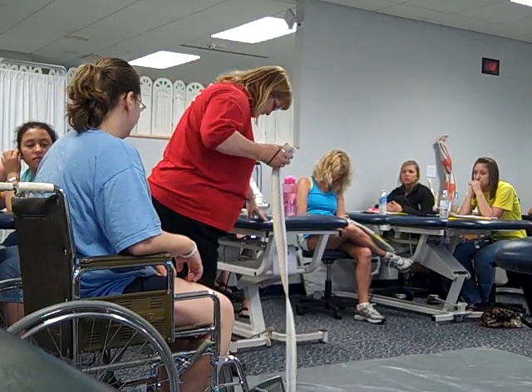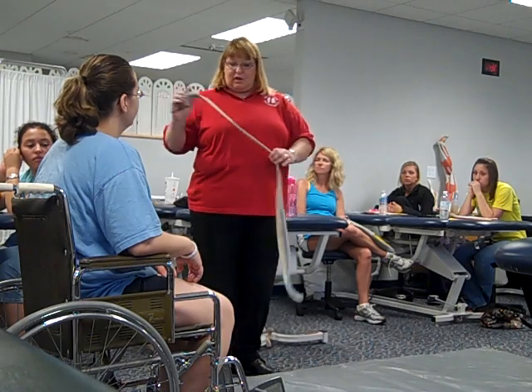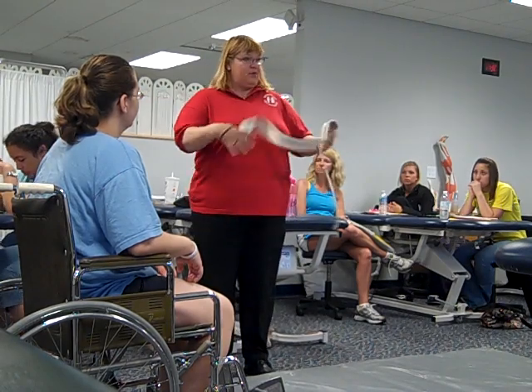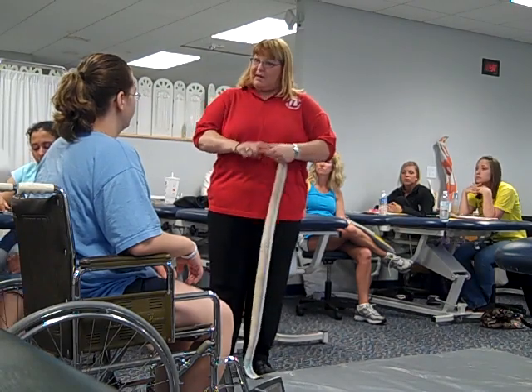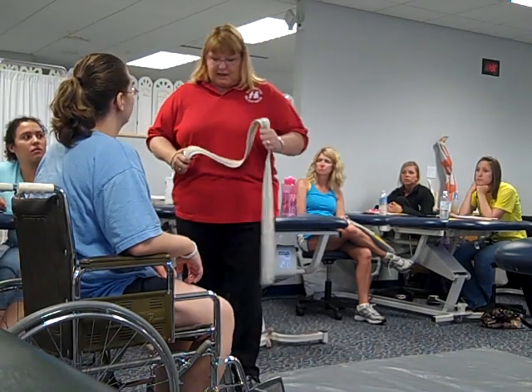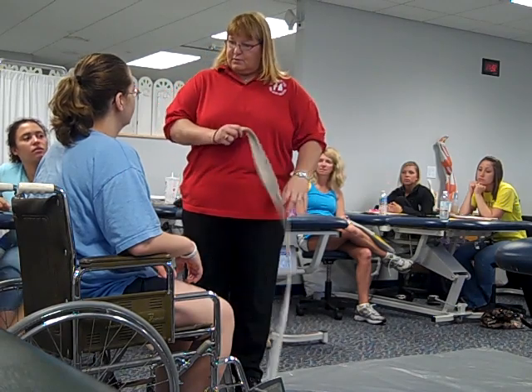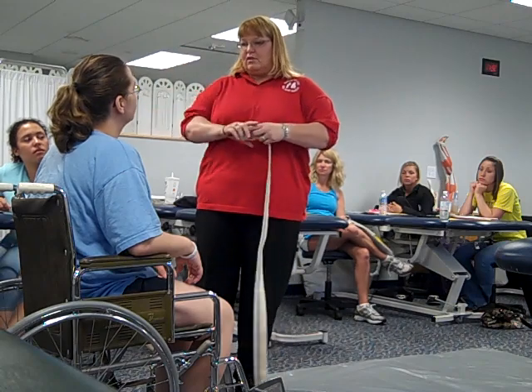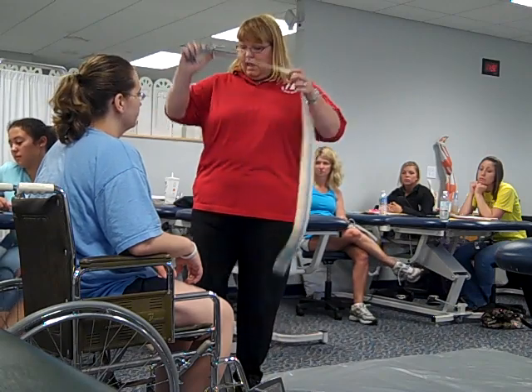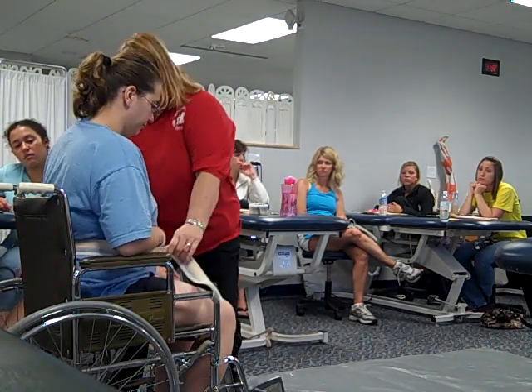For this one, remember we're saying that the patient's going to be a right-side hemiplegia, and we're talking about how to get down to the mat before we do the mat activities. So you're going to get from wheelchair to mat. My name is BJ Simmons, I'm going to be working with you today, and our goal is to get you down on the mat to start some exercises, because we're going to get you up walking and doing some things in the parallel bars. I'm going to put this gate belt on you so that I can help you as you're doing your activities.